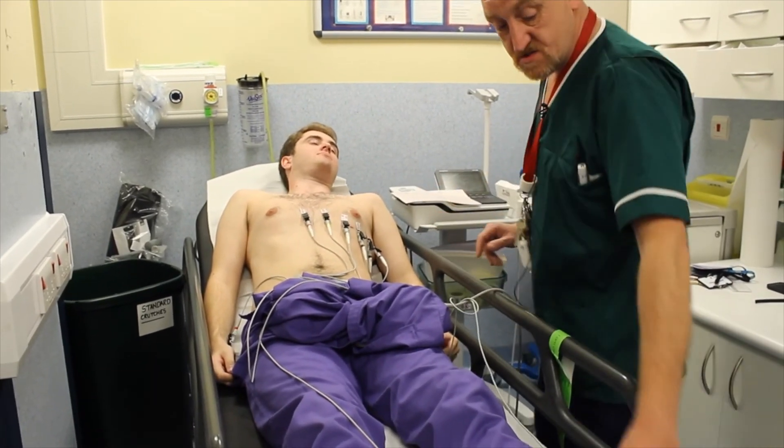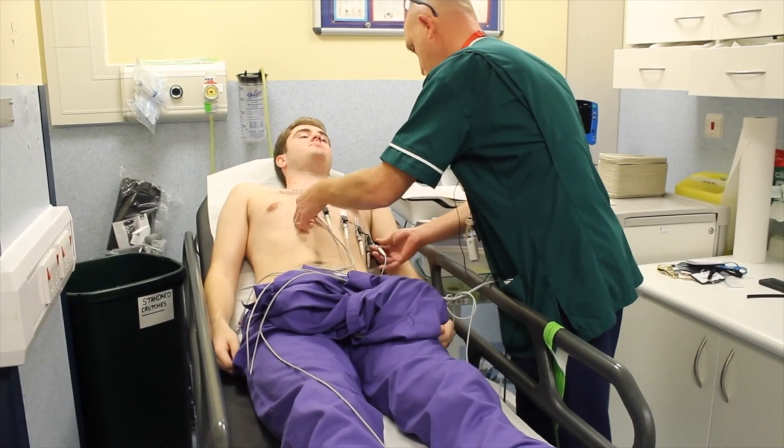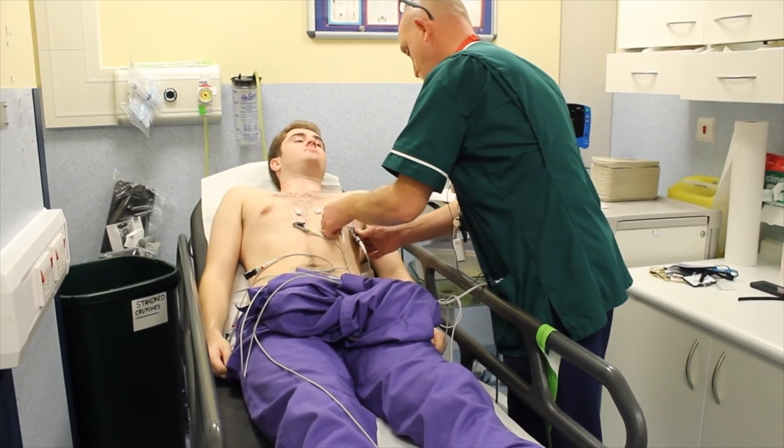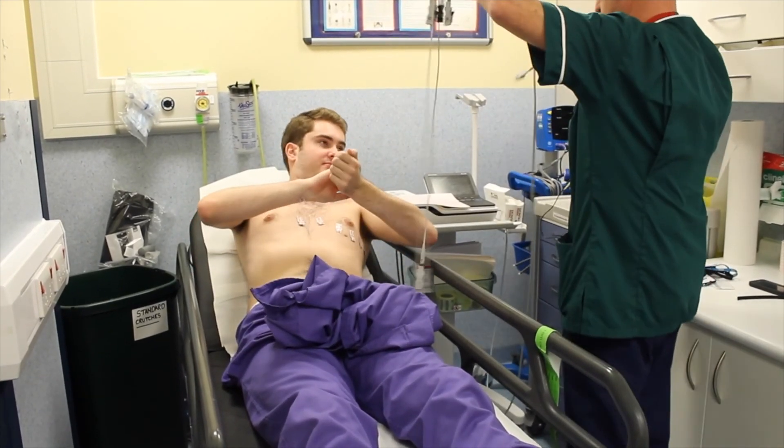Okay Jack, that's all completed. What I'm going to do is just get these off now. Are you okay removing the stickers yourself? Yeah, okay.